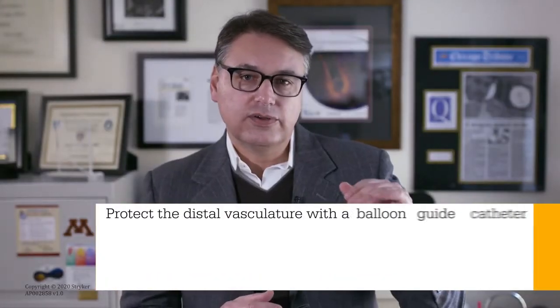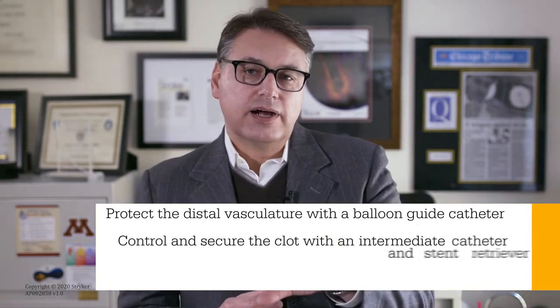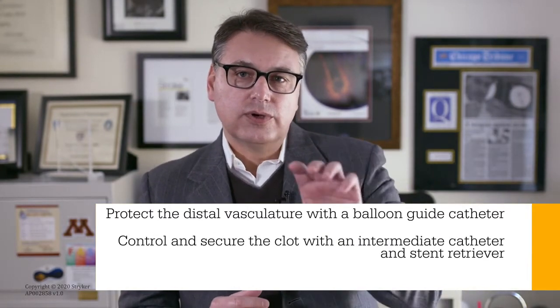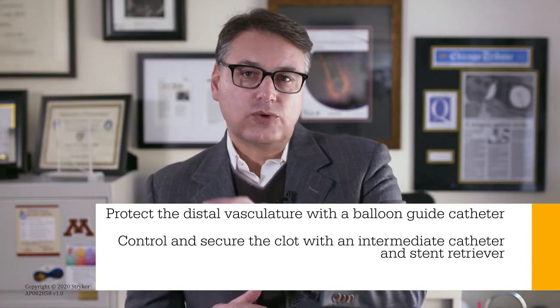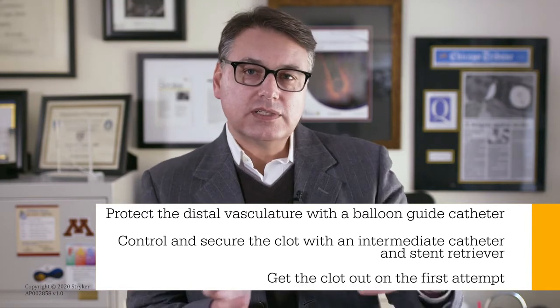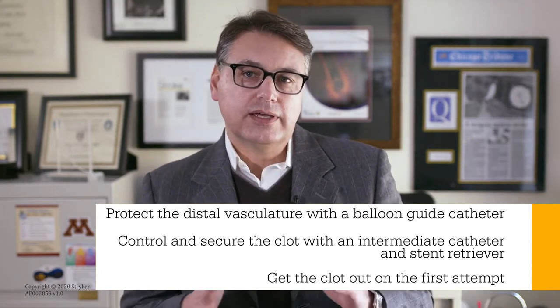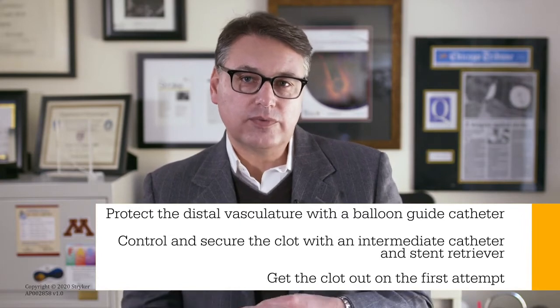First of all, you've got to have flow reversal and control the flow. Second involves the ability to control the clot or trap the clot. And then the third is the execution, to be able to do one pass and remove the clot with the cleanest type of revascularization, a TICI 3. The more often you can do that, the better.